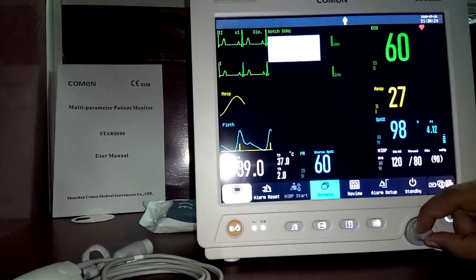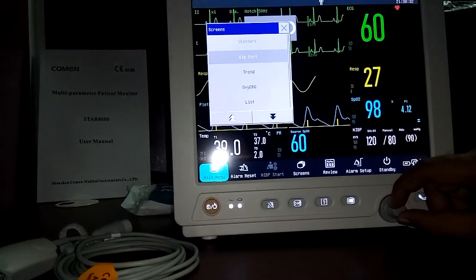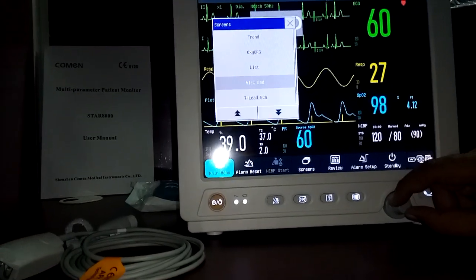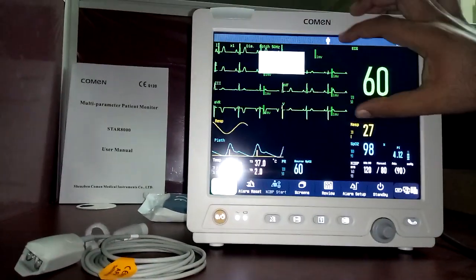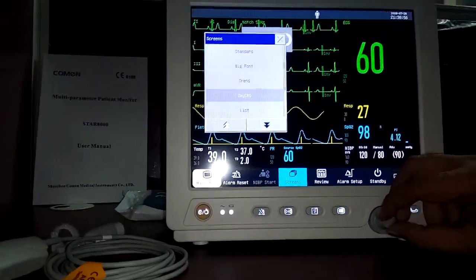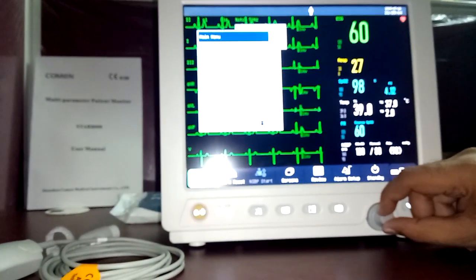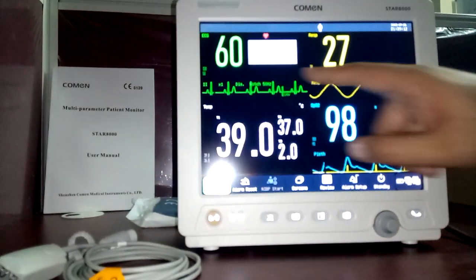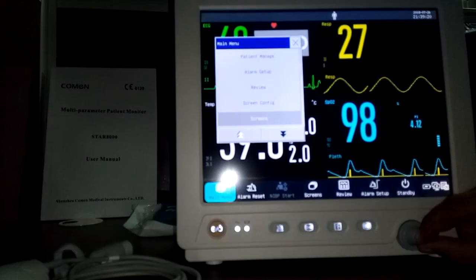There are eight types of screen formats available: standard, big font, trend, OxyCRG, list, face/bed view, seven ECG leads full screen, and seven ECG leads in half screen. In the big font screen format, ECG, respiration, temperature, and SpO2 plethysmograph are displayed in large text for easy reading.